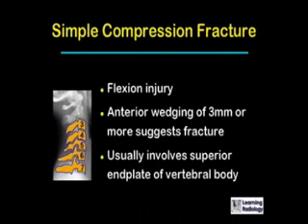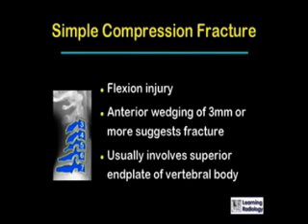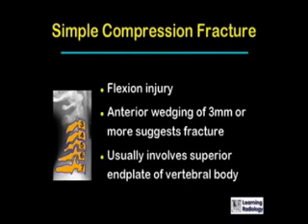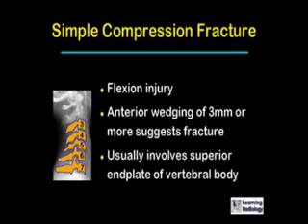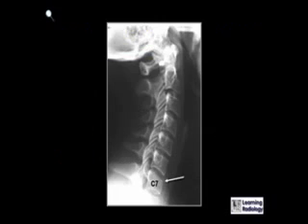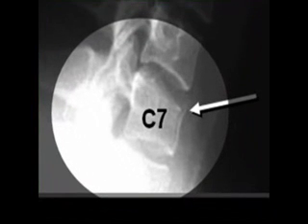Simple compression fractures are flexion injuries. There is anterior wedging of three millimeters or more, which suggests a fracture, and they usually involve the superior end plate of the vertebral body. This is an example of a simple compression fracture of the cervical spine — the white arrow is pointing to the superior end plate of C7, which is depressed anteriorly.